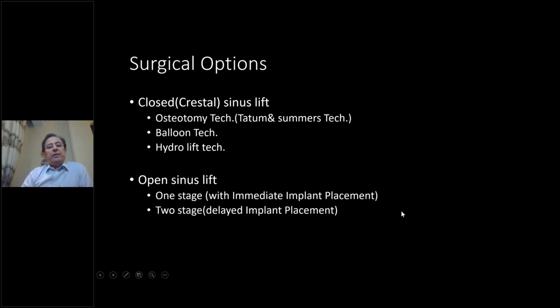Okay, after such an initial evaluation of the sinus graft and surgical notes in relation to them, we have two main options for sinus augmentation. The first one is closed or crestal sinus lift, which we can do with the osteotome technique, originally introduced by Tatum and completed by Summers.